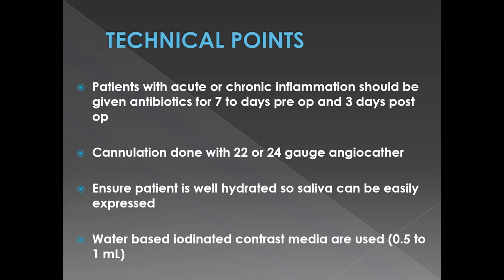So once you have done that, then water-based iodinated contrast agents are used. The same agents are used which are used in CT scans. You can use diatrizoate. You can also use iohexol. Any iodinated contrast agent can be given.